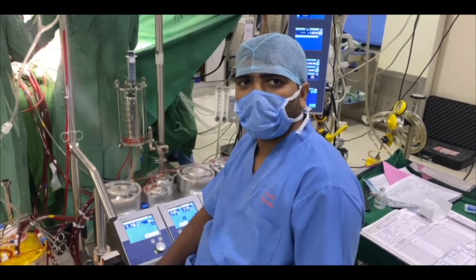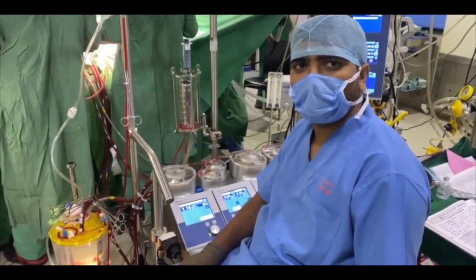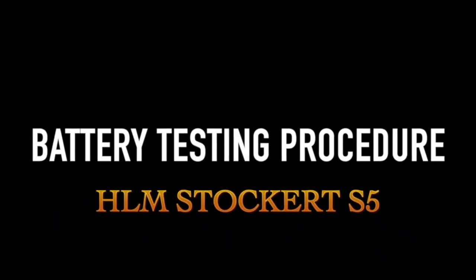Hello guys, welcome back to my YouTube channel. My name is Stephan Bore and I'm a clinical perfusionist since the last 13 years. Today I'm going to share with you how to do the battery test procedure using the external battery which came with the new heart-lung machine of Stockert S5.